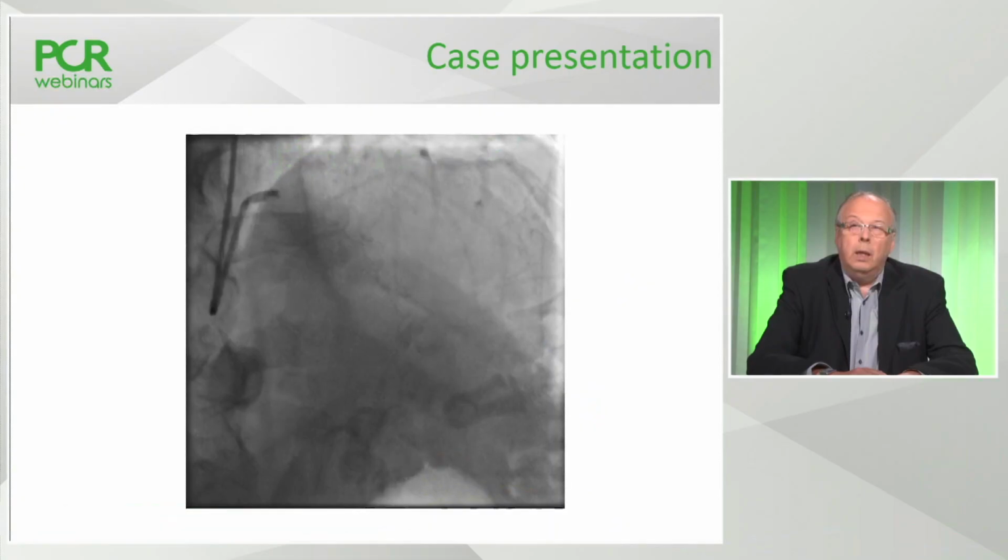Would you consider an upfront two-stent strategy in this case as well, or do you intend to start provisional and then decide later on? There are two different ways of performing culotte, depending on the position of the first stent that you put. Yes, for sure. I think it's a good case for culotte for many reasons. First, we have a long disease on the side branch, and there is little chance that you can achieve an optimal result with only ballooning this side branch. So I think it's a reason to put two stents in this case.